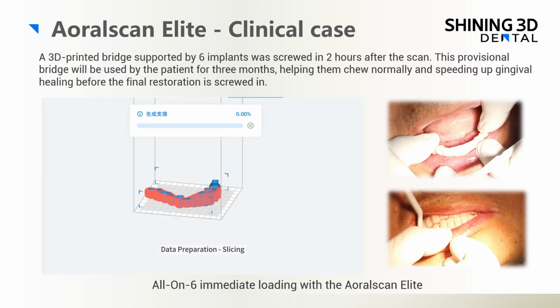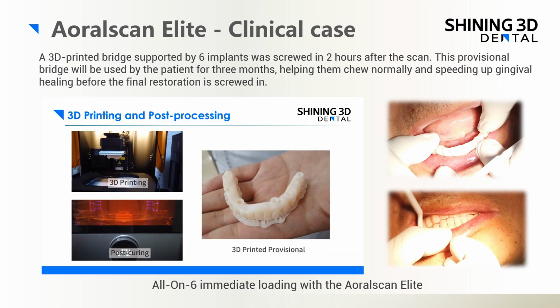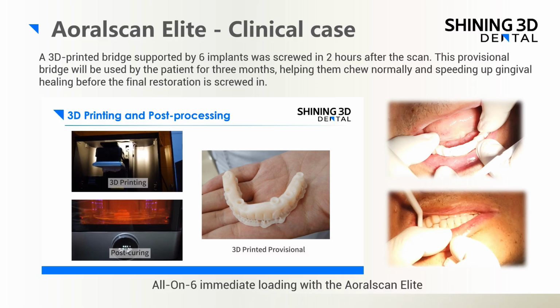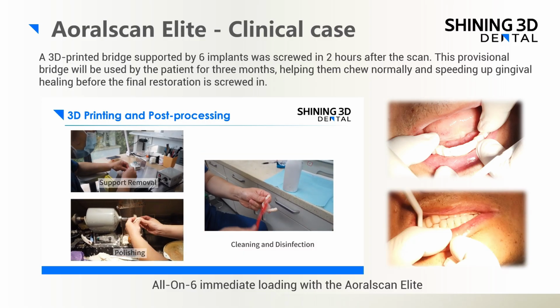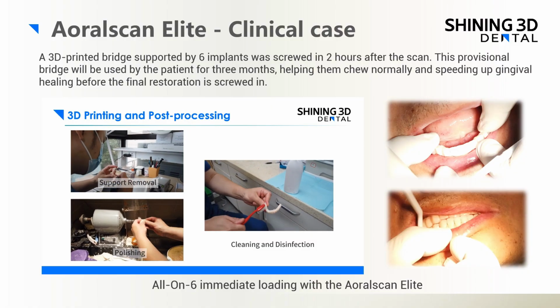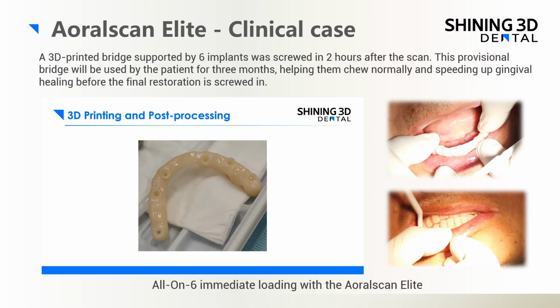After capturing all necessary data for this kind of case and getting the design data back from the lab that you collaborate with, the design file can be sliced and printed using the Shining3D AccuFab cell printer, and you can finish the whole printing within 20 minutes. After that, a curing process of 10 minutes is required to achieve optimal material performance. After post-polishing and sterilization, the patient can proceed with the trial fitting.